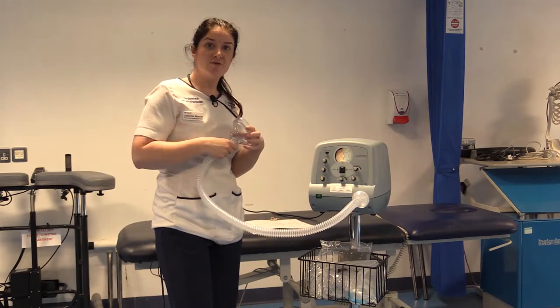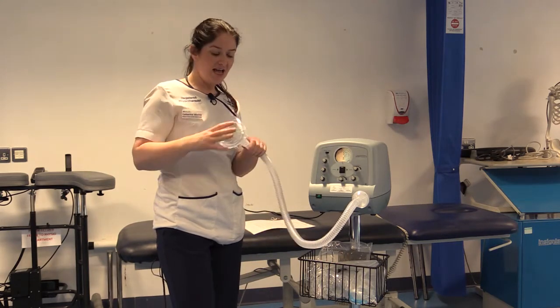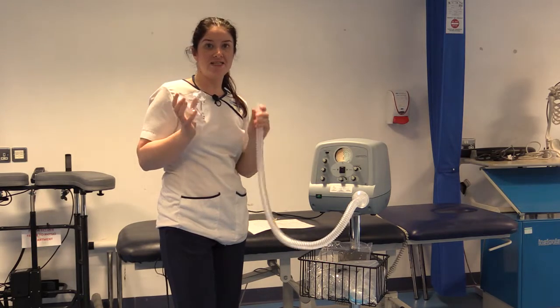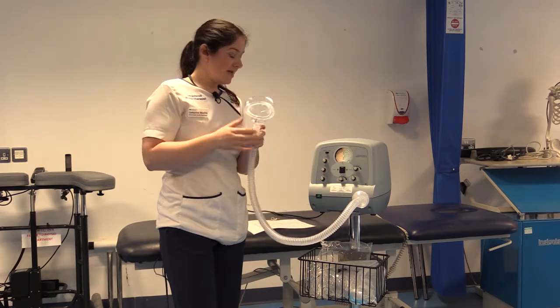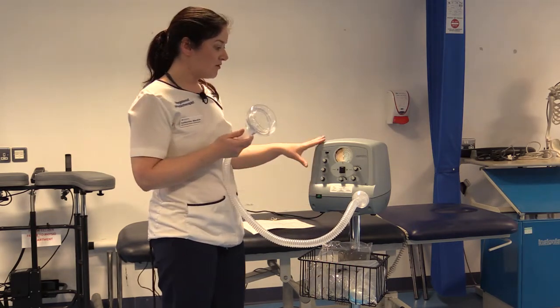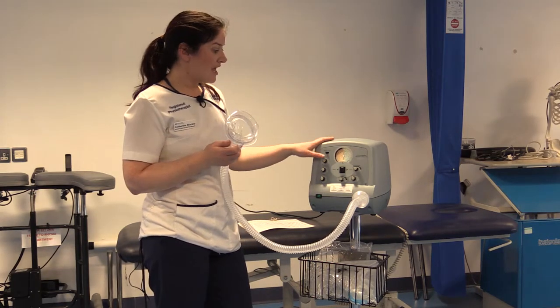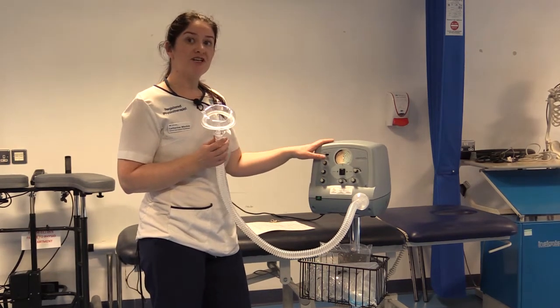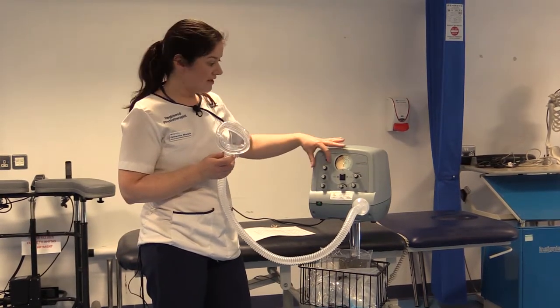With our patients currently with COVID-19, we're recommending using a second filter, which is placed just before the face mask itself. That is the machine ready to use with a patient. Now I'm going to go through the dials. In the hospital we generally want to use a customized treatment, so we normally use it on manual mode.